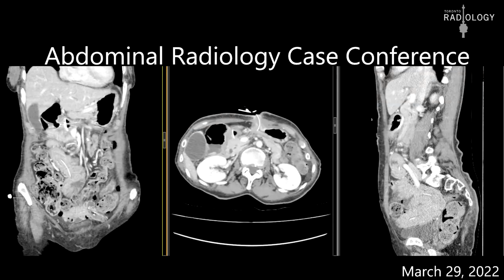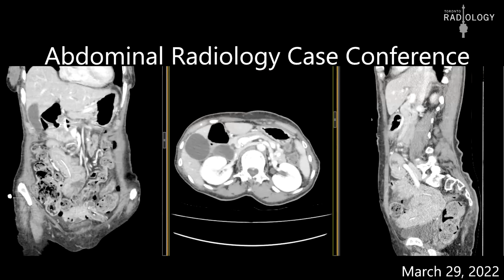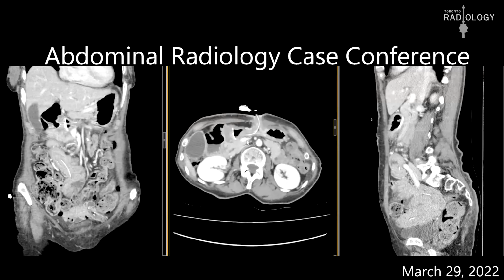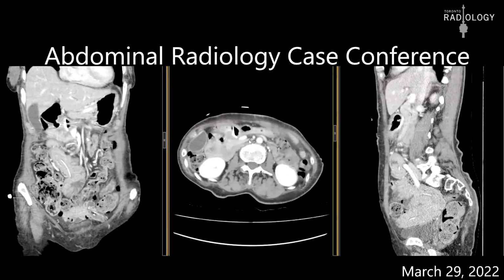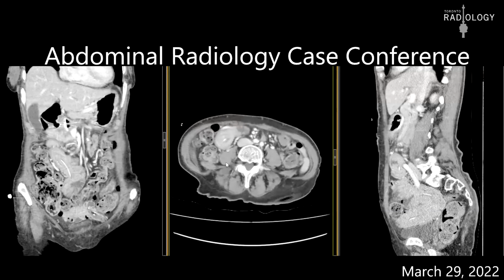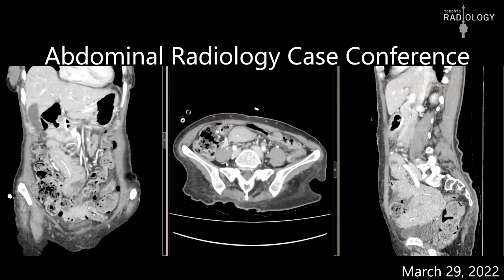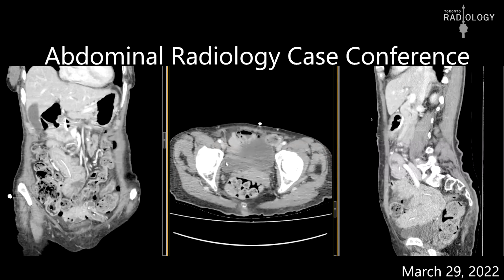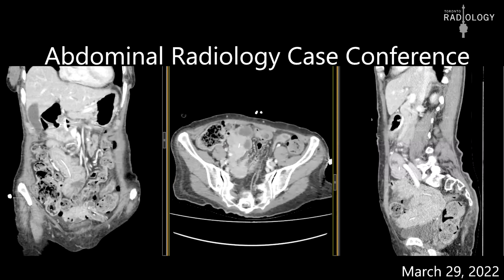I think this was an interesting case which I saw. So let's have a look at the CT. Patient presents to emerge. It was one of those patients who presented late at night when you think your shift is done, but then you have this and then you're stuck. So have a look at the bowel and see what you think. I'll just scroll down slowly.